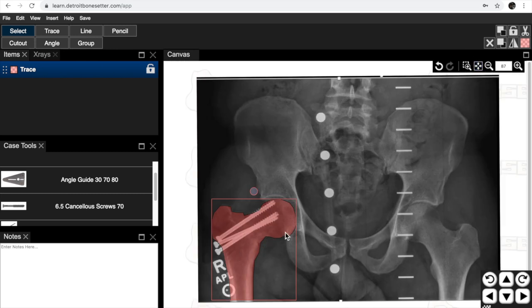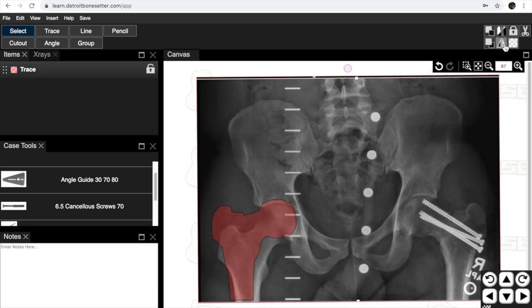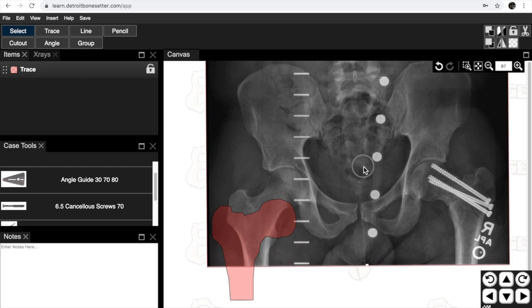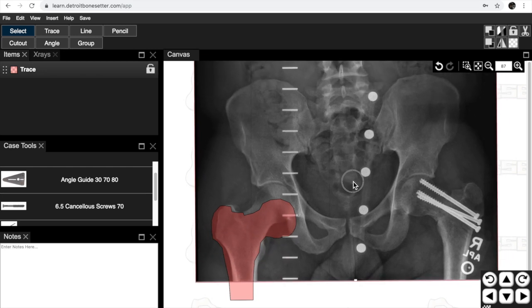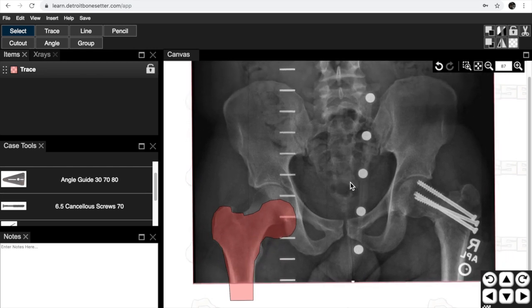Now if we want to compare it to the normal side, we just have to click on the x-ray. See the ball comes up again and then go to this flip tool and that'll flip it over. So now the normal side can be compared to the broken side.